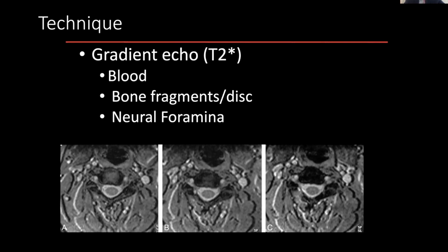So you may have a very small microhemorrhage, and you may see it better on a gradient or a T2 star or hemosiderin sequence because of that mechanism that I just said, if that makes sense.